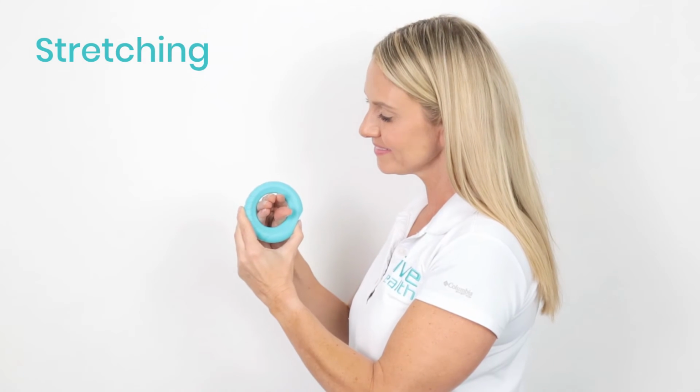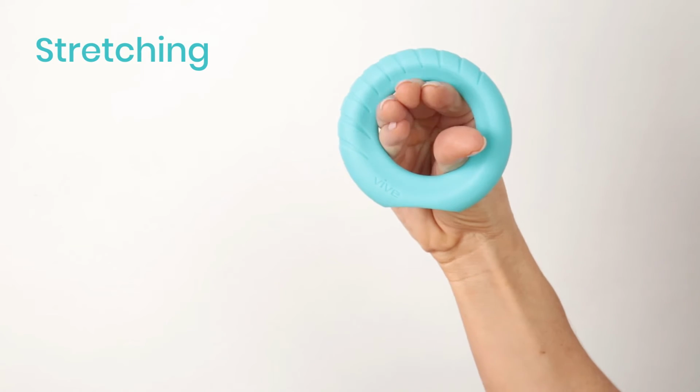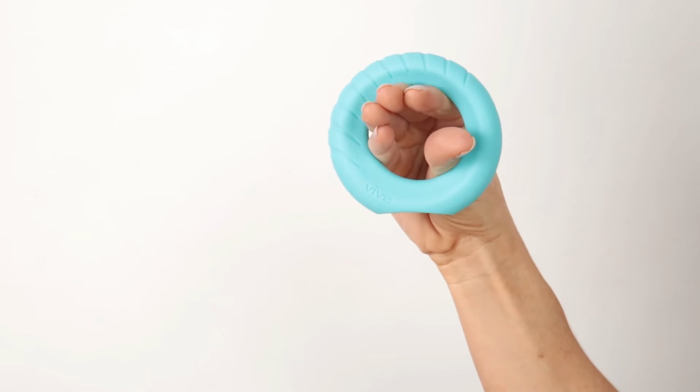Stretching. Insert your fingers into the hole in the middle of the ring and extend them outward.